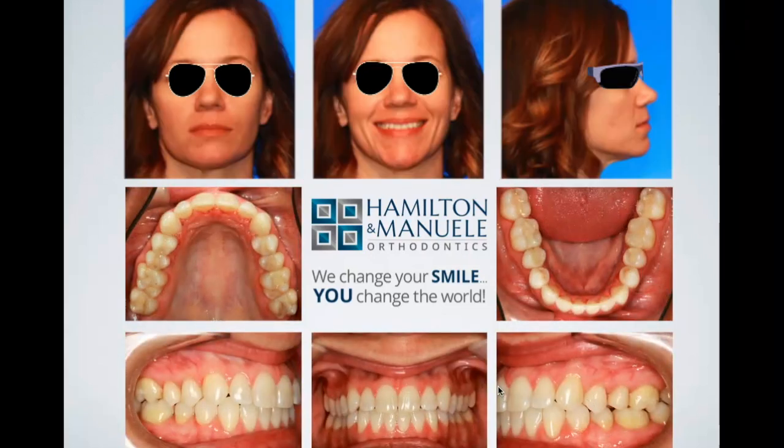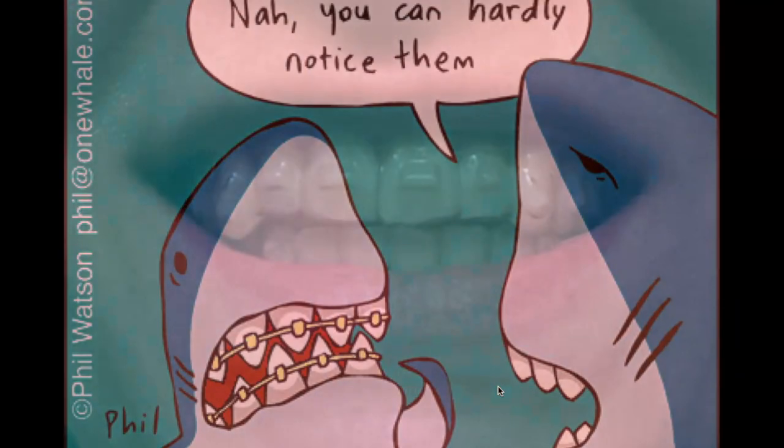So this is where we finished. You can see we didn't level out completely on the upper arch. Definitely still a little bit deficient in the incisor display area. But she was happy with the result, and she ended up moving shortly after that, so we had to get her finished up. But definitely a little bit less noticeable, even than aligners.